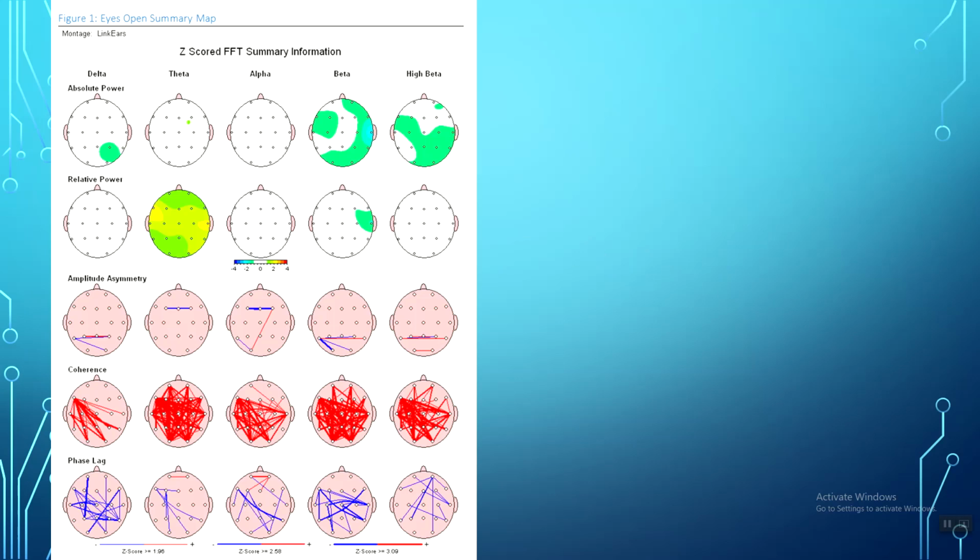Yep. And what red in coherence means is hyper coherence. Coherence is the stability of the phase relationship between different sites in the brain. That's a formal definition. That's a great way to explain it: stability of the phase relationships between different sites in the brain. What does that mean? The keywords that I like to pull out there are stable relationship, okay? And so when you have a stable relationship with your partner, you come home at the end of the day.